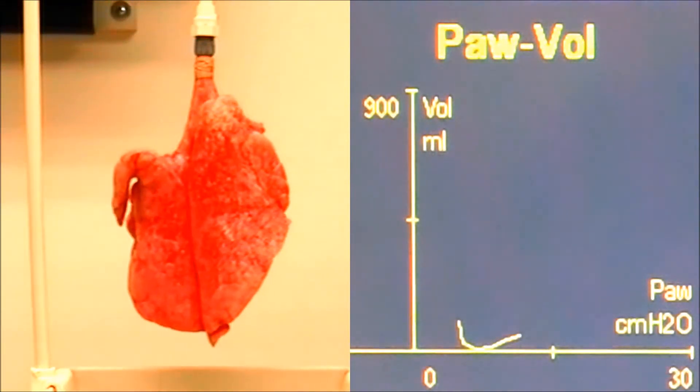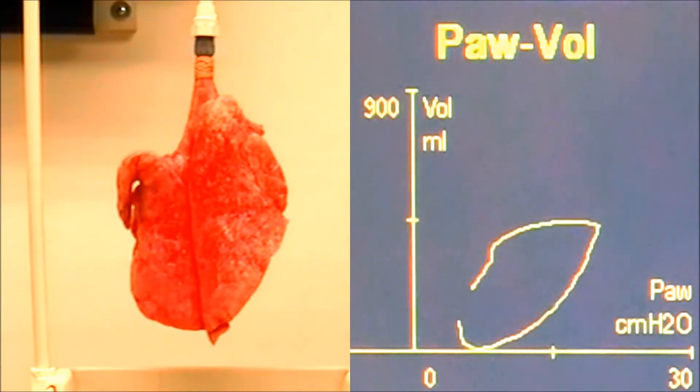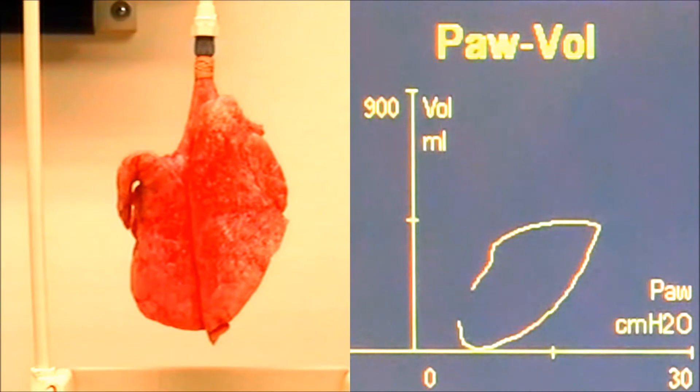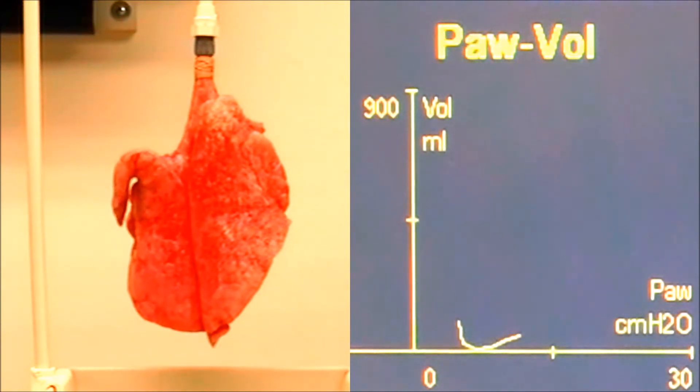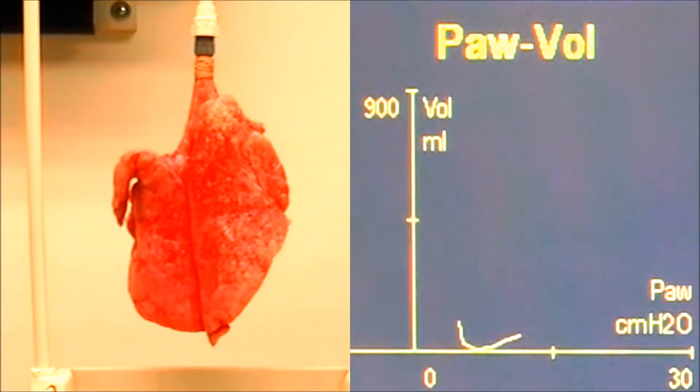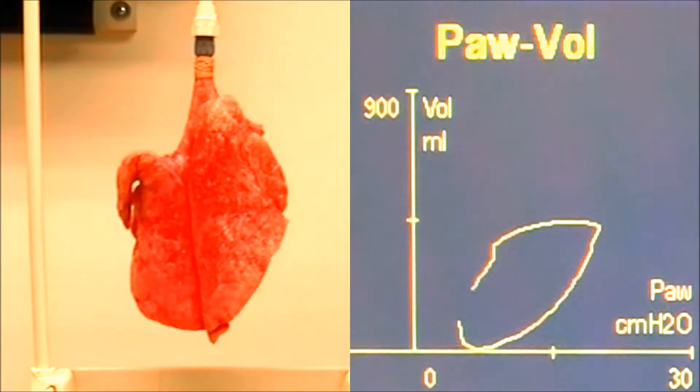In this video, we're going to demonstrate a sustained recruitment breath using the bag. If you take a look at our lungs, you can see that there's a lot of atelectasis. The darker areas are atelectatic, and the lighter color is aerated.